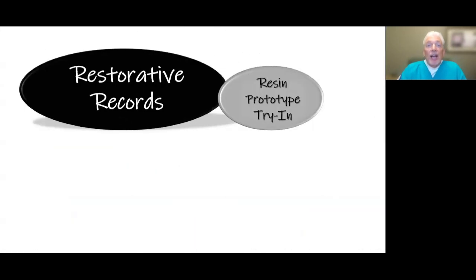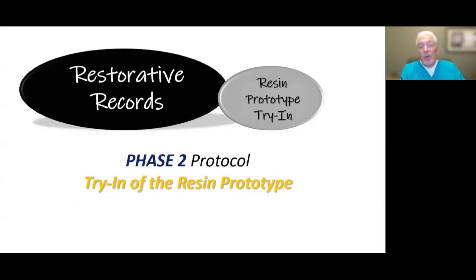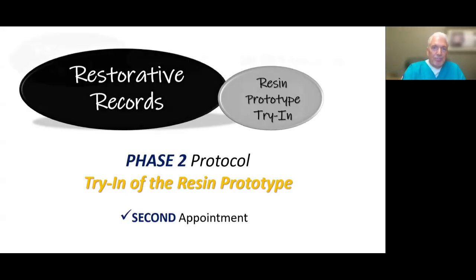Okay, so now we've sent that data to the laboratory, whether the turnaround is 2 weeks or 3 weeks, I'm not sure what your laboratory's time frame is going to be to fabricate the resin prototype. Again, that's why you talk to your laboratory. So now we're at our second restorative appointment, which is trying in the resin prototype.